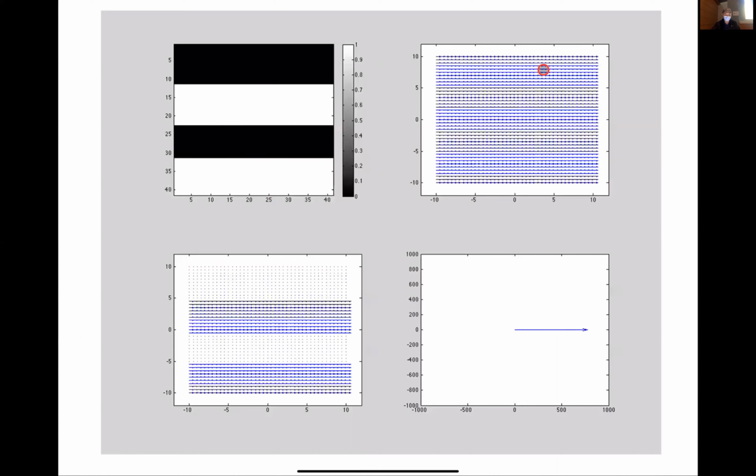And this is going to be the spatial Phasor pattern that's imposed. And this is what happens after I multiply this spatial Phasor pattern by my object. So basically it's zeros here, and then only the spatial pattern lasts here. And then this is going to be the complex sum of all these Phasor patterns.